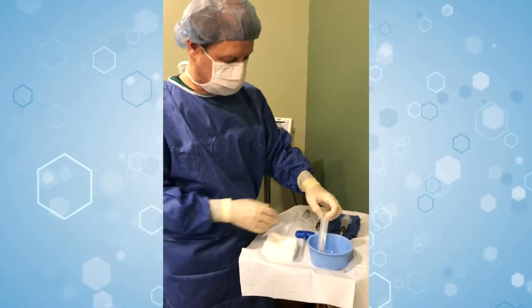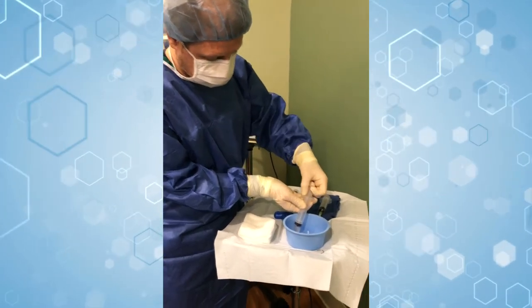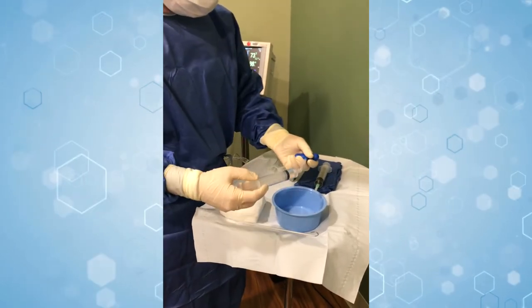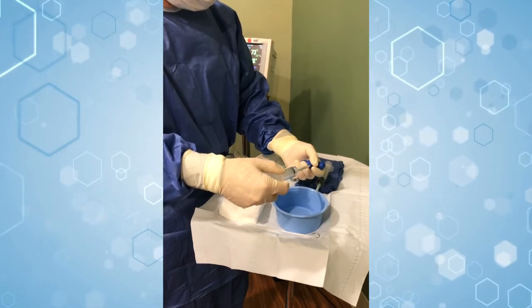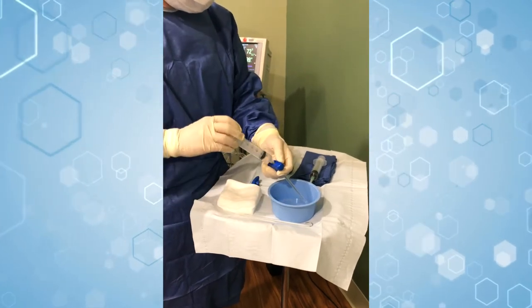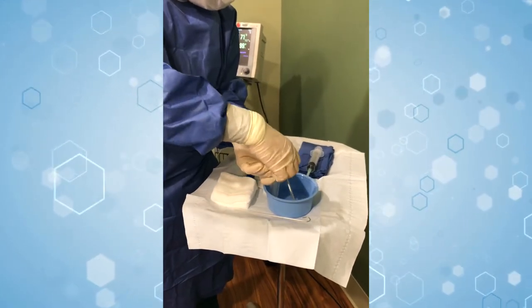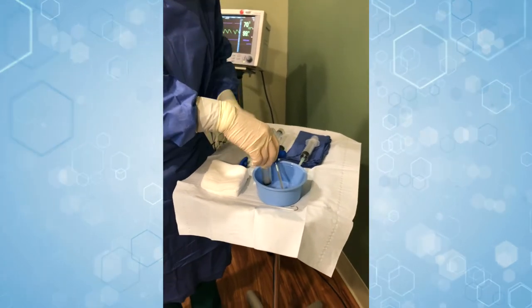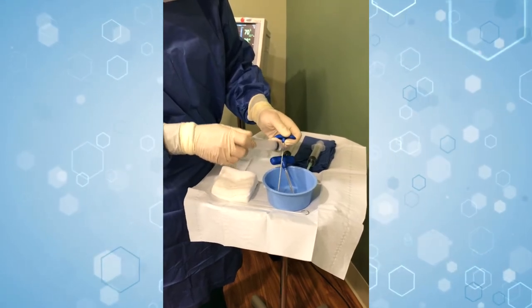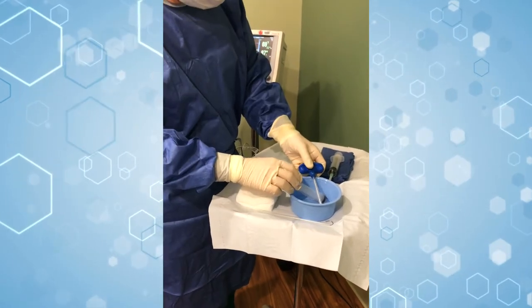Now what we're going to do is something called charging the equipment. We don't want the bone marrow to clot on us, so we're going to use heparin to bathe all of our parts that we're going to use around the bone marrow — mainly the Jamshidi trocar. So we're just going to put a bunch of heparin in there, let that sit, pull this part out, and run heparin through. And now we're going to put heparin over what's called the stylet, which is the part that goes in the middle. We run heparin all down that, and we should be ready to go.